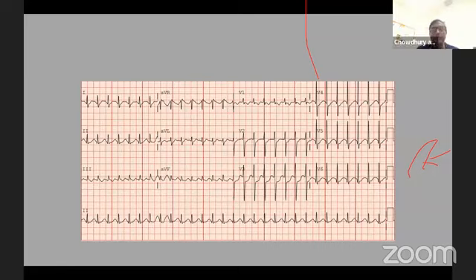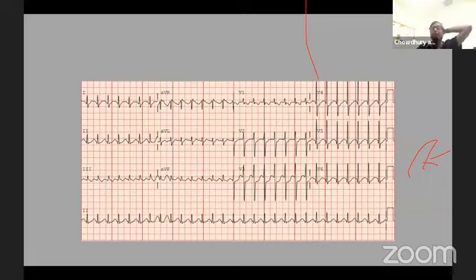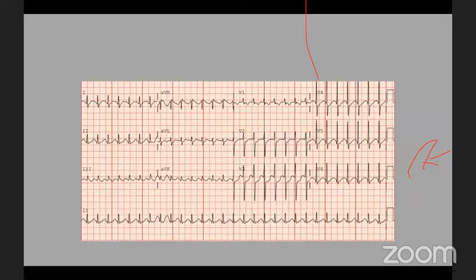This is also from this morning. So this is ST depression in the precordial leads. Are we worried? No, no. These are part of this pathology, the narrow complex tachycardia. This helps to distinguish AVNRT from AVRT.